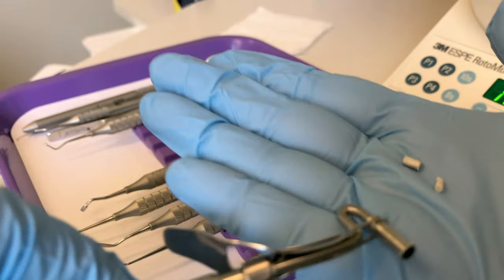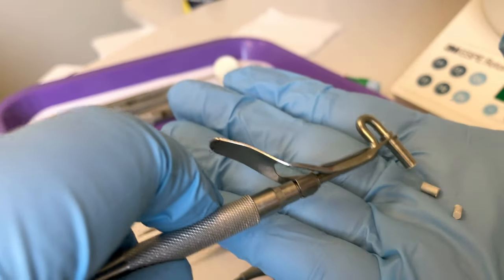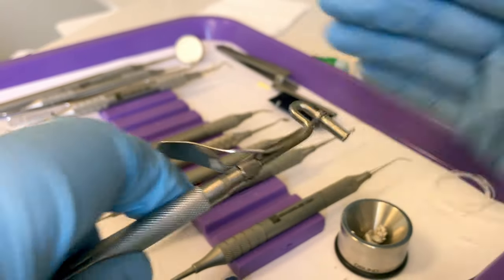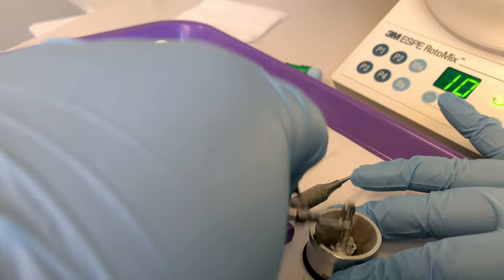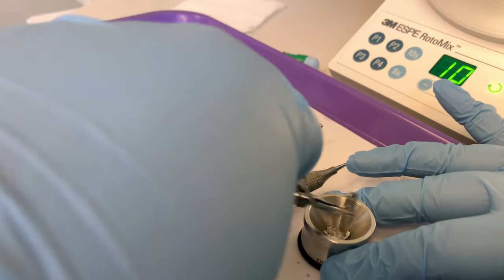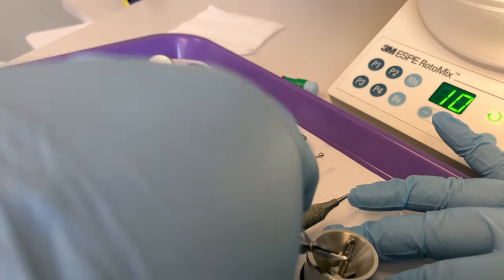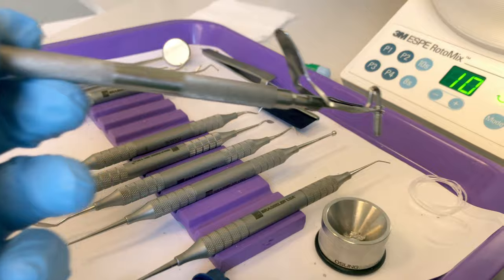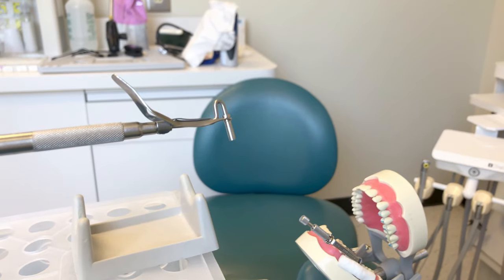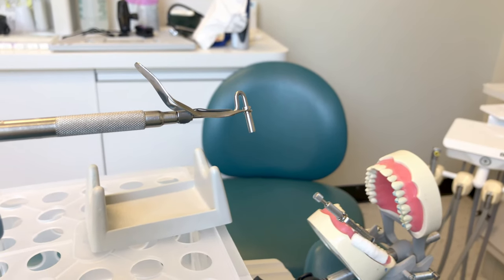The goal for the assistant is to pack this firmly enough that you get nice solid cylinders. Crumbly mixes will just fall out, so when you hold these carriers upside down, your amalgam mix should not fall out. You have a limited time to work with your amalgam — this is a fast-set amalgam.